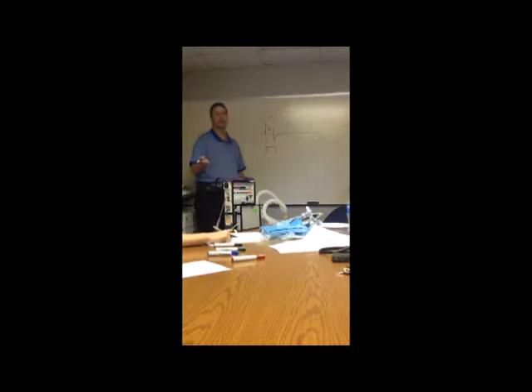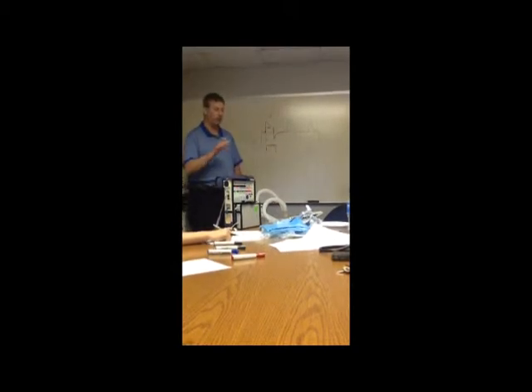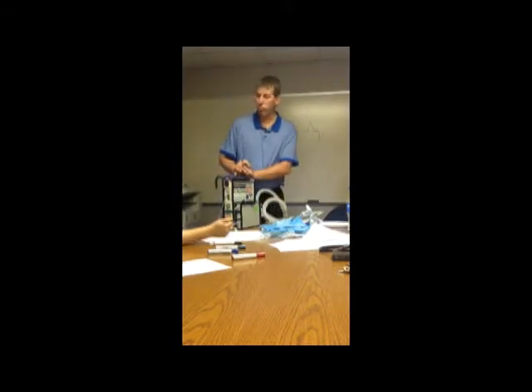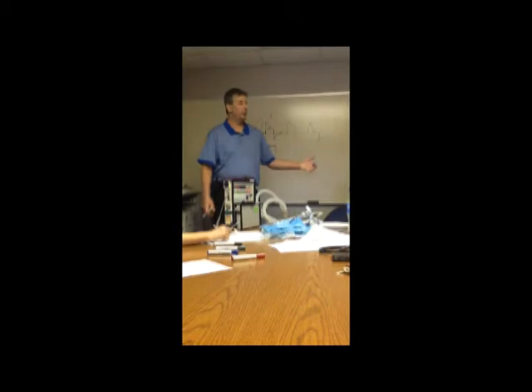It's the best number to use when deciding which way to go with your settings. And we'll talk about that a little bit more. So that's the first thing you want to know from us when we show up with the patient. Well, it's the first thing I want to know when I see a blood gas from the previous hospital: what was their minute ventilation?